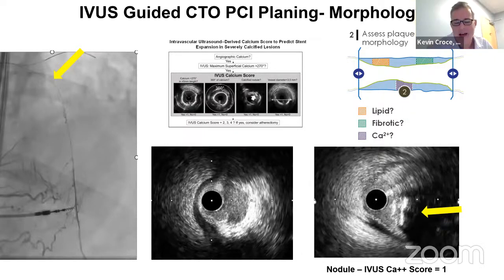That's my comment. I appreciate that, because you always teach me things. It looked like a nodule, walked like a nodule, and quacked like a nodule, so that's what I thought it was. But understanding I'm in a different space and how to read these from the backside is helpful.